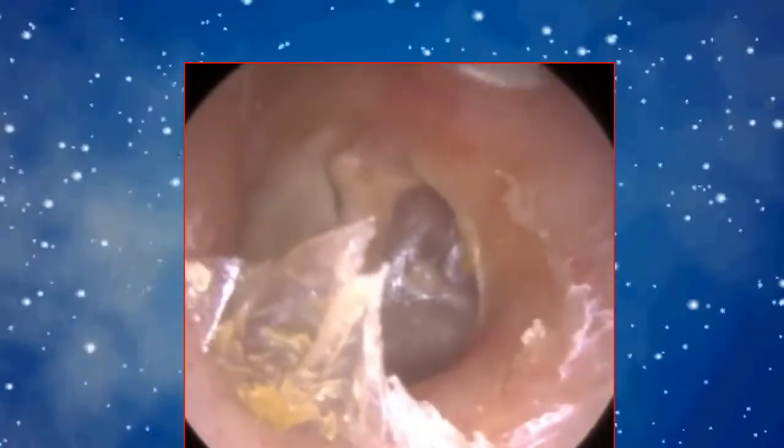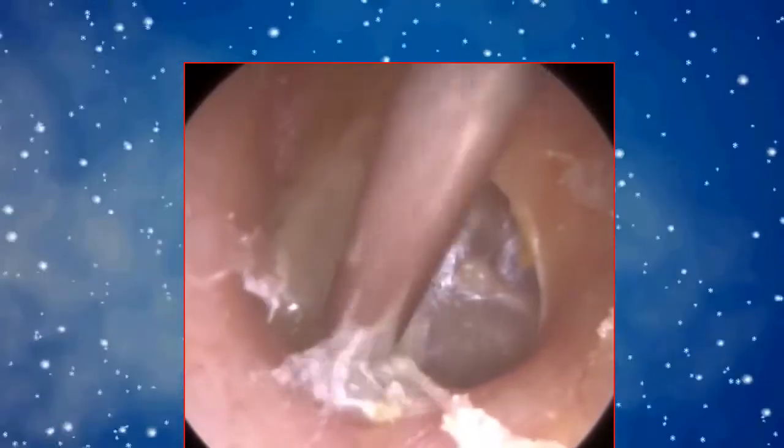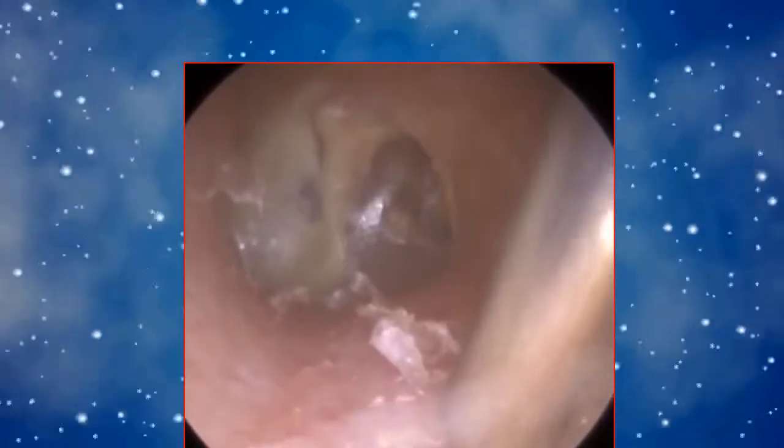So the patient's got eustachian tube dysfunction, which causes negative pressure behind the eardrum in the middle ear, a bit like when you're on the aeroplane, when you're descending. So the eardrum's got sucked in, and you can see the hammer bone, which you can normally see when you examine a normal, healthy ear. The hammer bone is what we call the malleus, and that's in the middle, attached to the eardrum. But we can also see the patient's stapes, the smallest bone in the body, because the eardrum is sucked in so much, it's wrapped itself over the head of the stapes.